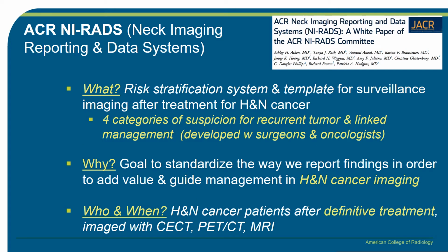NI-RADS is a risk stratification system and a template for surveillance imaging after treatment for head and neck cancer, with 4 categories of suspicion that we are going to review. The major goal is to standardize the way that we describe and report findings in order to add value and guide management. Who should we be using this template on? Head and neck cancer patients after definitive treatment, and when brings us to the next slide.